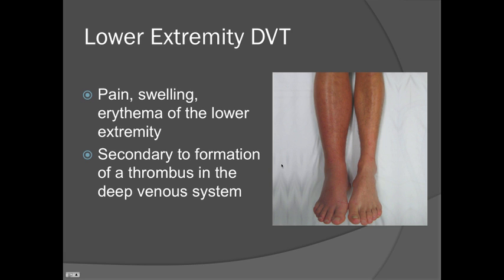And as the name implies, these DVTs are due to an actual thrombus that forms within the deep vessels of the venous system in the lower extremity here.